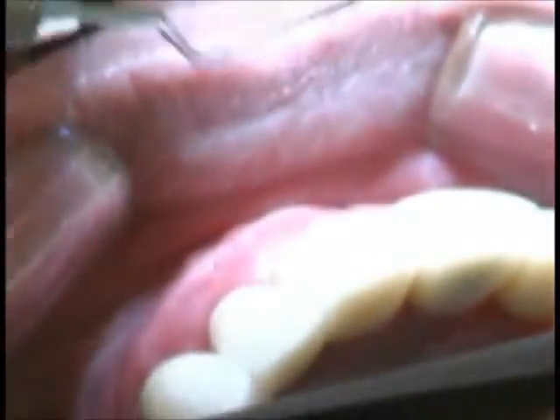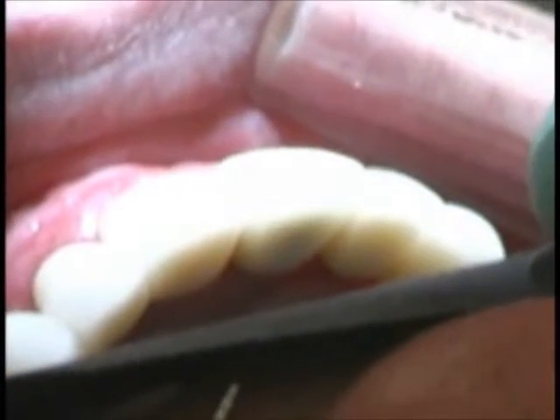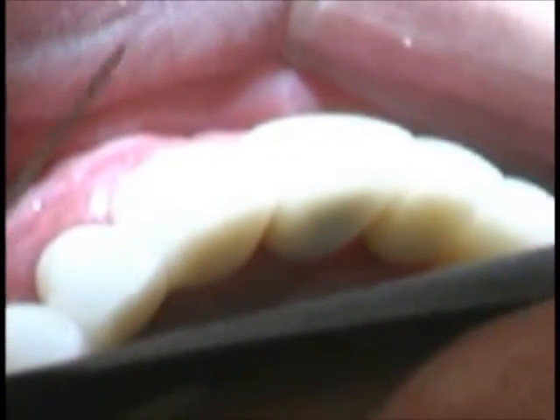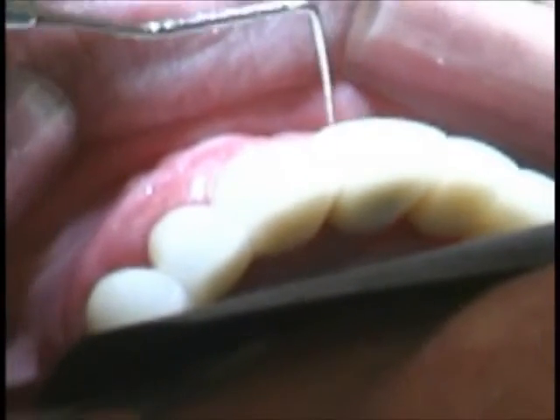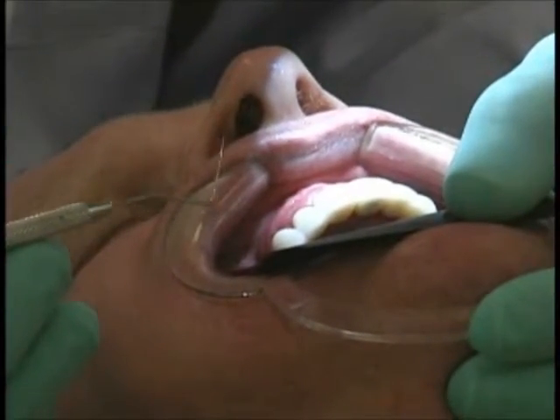We didn't actually augment it any or bring it up more coronally, but certainly we've augmented it and regained the health of this soft tissue along that line. And all of this is done with one surgical intervention in this endeavor.